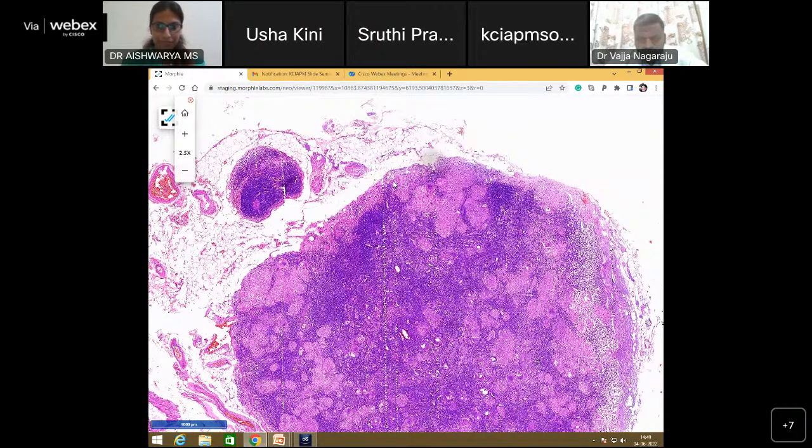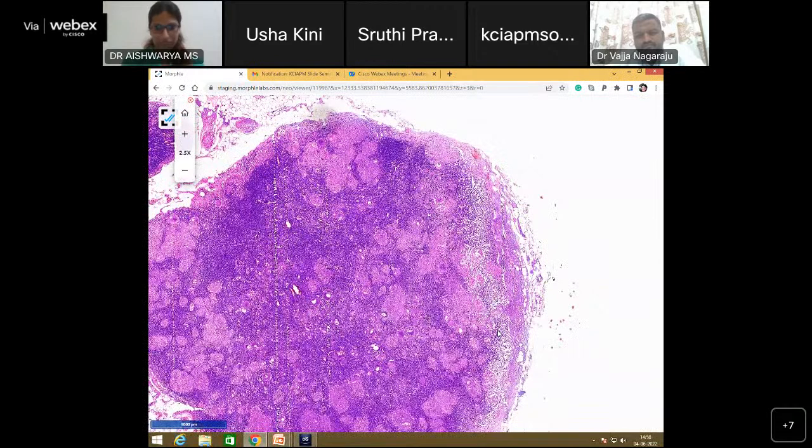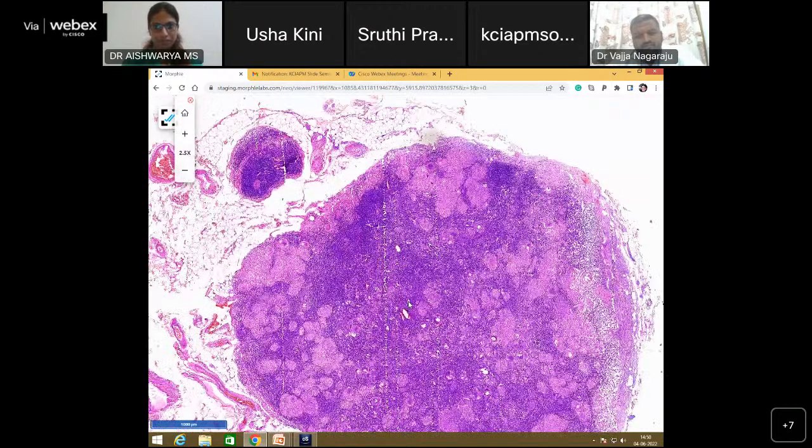So you're very right, but you cannot use the word effaced because where there are no granulomata, you're able to see the sinuses. And probably you're not able to differentiate between cortex and medulla because there are two lymph nodes which are jam-packed with granulomas. Also it depends on the cut. You get to see medulla when the cut goes through the hilum, right? That is when you can differentiate. Otherwise, you will be seeing only cortex. Then you say, I don't see medulla.